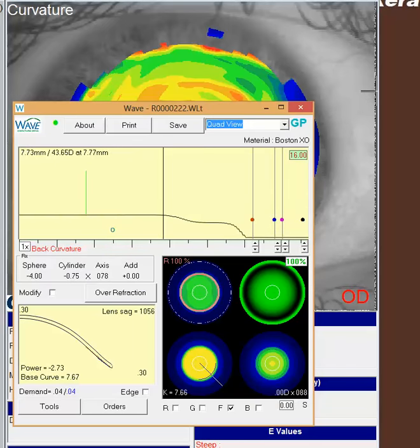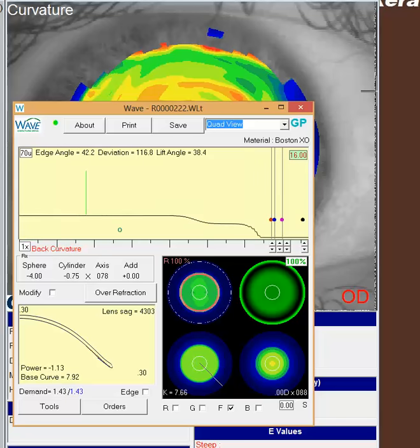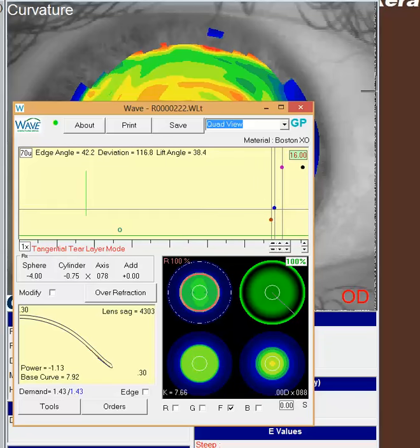So if we're at about 7.5 or so, what you want to do is just get it larger. The easiest way to do this is just take this optical zone and go a little bit bigger. If you're 12.6, you can slide this out to about 1 millimeter out and see what happens. If you go out to a 13.6, you end up with a lens that still actually looks pretty nice here. You've reduced this little landing zone, but it sounds like you have a pretty nicely fitting lens to begin with, and that little change probably won't change a whole lot as far as the fit goes.